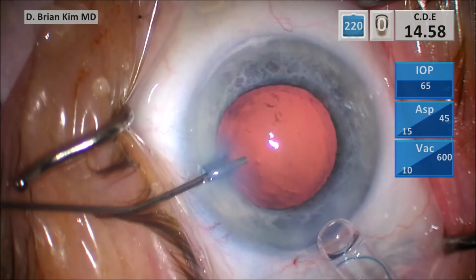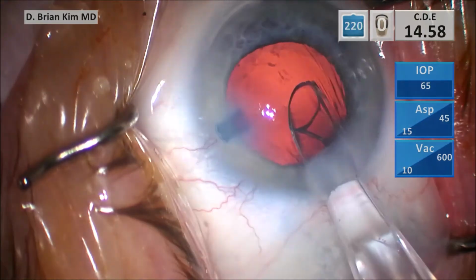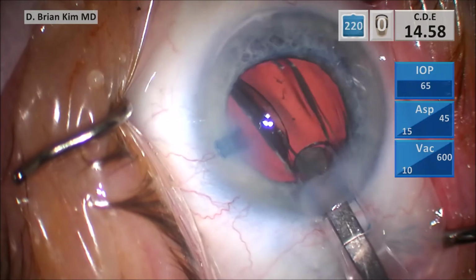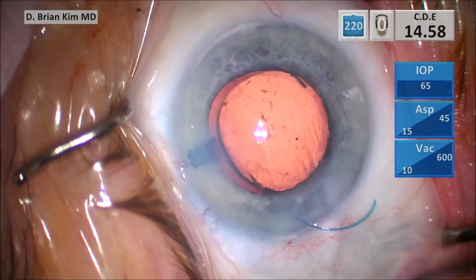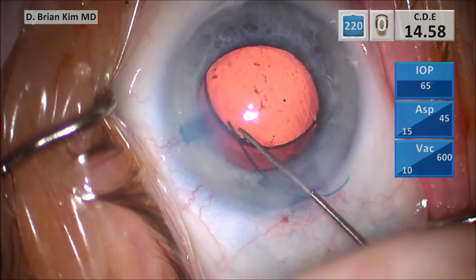I'm switching to the cohesive viscoelastic cannula so I can fill the bag a little bit more. I go in with the 3-piece lens, pointing the barrel to the left. The leading haptic goes into the bag. Rotate my wrist so the optic comes out flat. The trailing haptic is out of the bag, and I'm using the Maltzman to dial the trailing haptic into the bag.